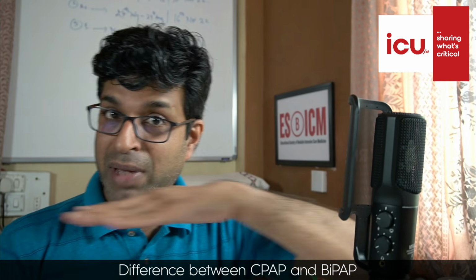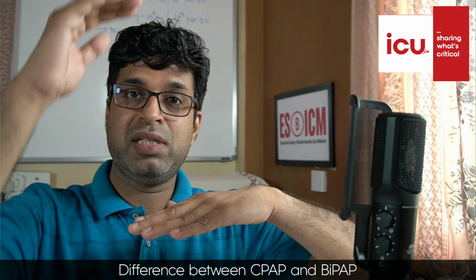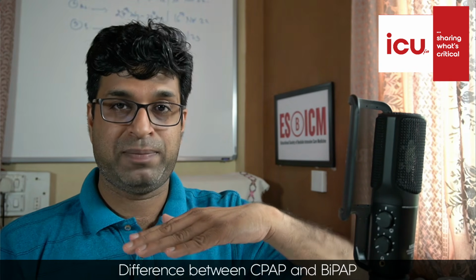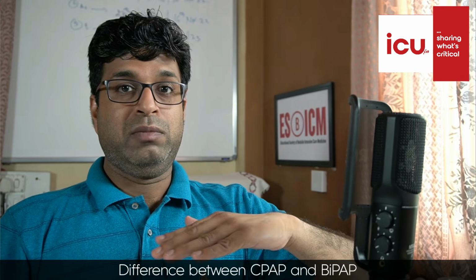In this, the pressure which remains at a constant level is called the EPAP, expiratory positive airway pressure, and the pressure which increases during inspiration is the IPAP. So what happens in BiPAP? You will inhale like this.